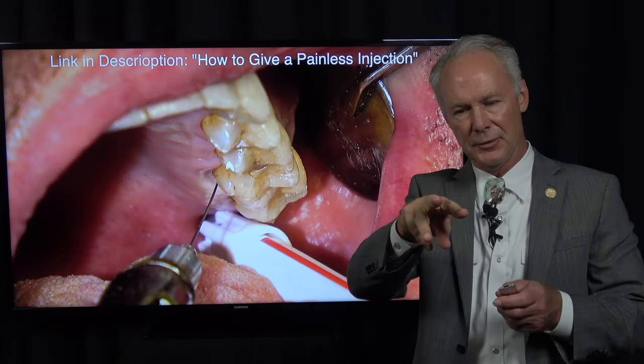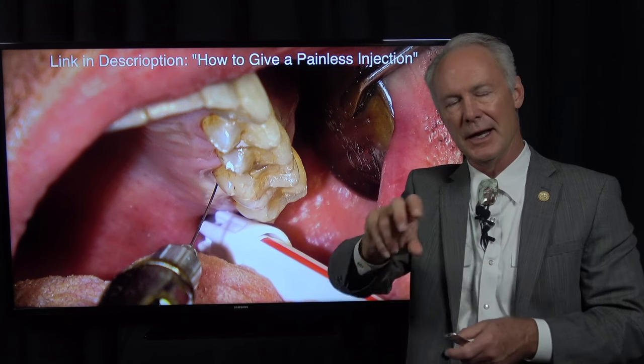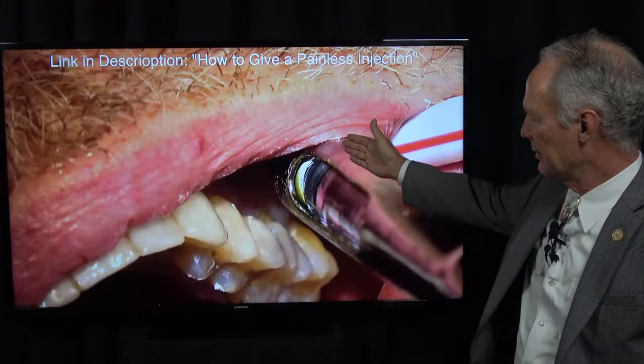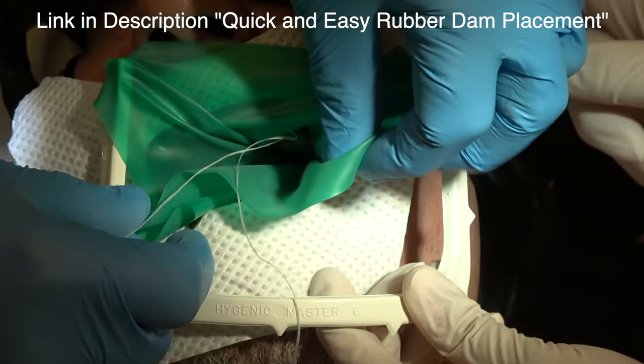So what I'm going to do is extract the tooth in three pieces. It has three roots and I'm going to section the tooth, cut between the roots, and take each root out individually, and preserve the facial and the palatal alveolar crest walls.